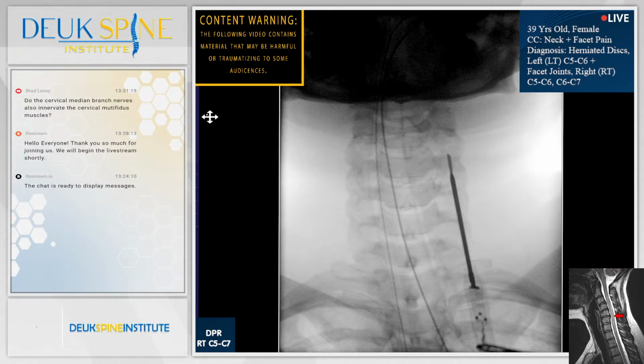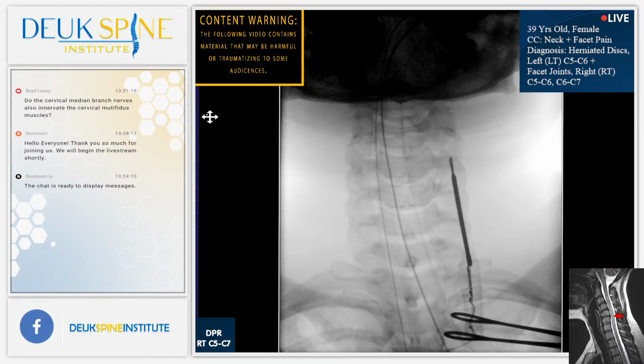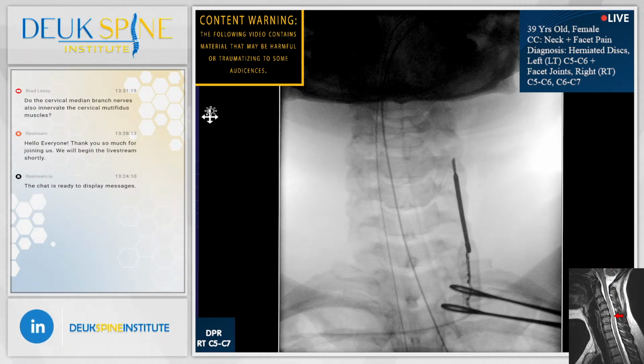Okay, we are now over the first joint, which is C4. I'm going to start with 4 because her pain is a little higher, and I got her permission to treat what needs to be treated. I want to make sure we get rid of this pain. And I'm just about in the perfect spot where the pain nerve is. Jordan, you want to show the audience where that pain nerve is? It's right here, right where I'm deadening. That's it. Shot. Yep, right exactly where I'm at, folks. It's a perfect spot. Just got done with one. We're going to move down to the next one.